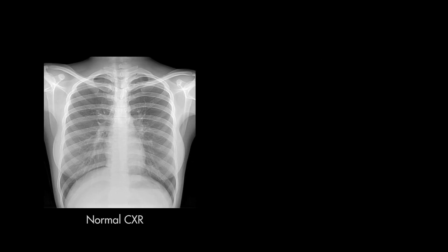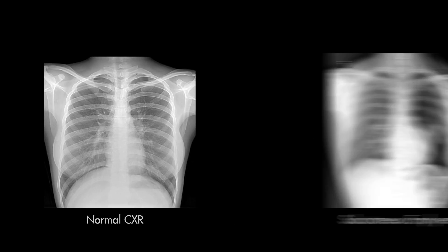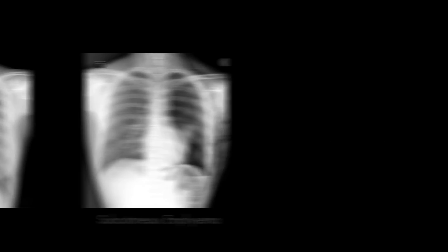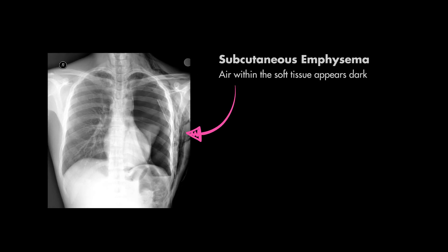Finally, don't forget about soft tissues. To illustrate how this can be abnormal, here's a normal x-ray. Now here's an x-ray with subcutaneous emphysema after a procedure. This area here is air within the soft tissue, in this case from a chest tube that was placed.